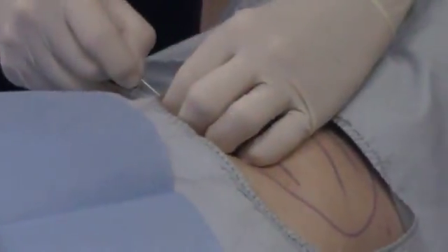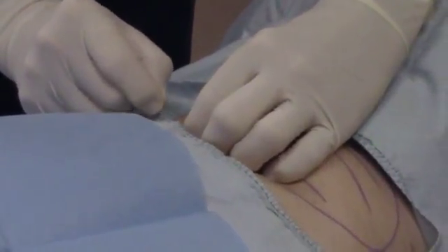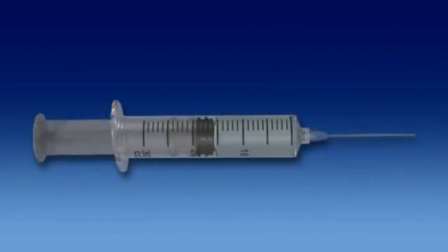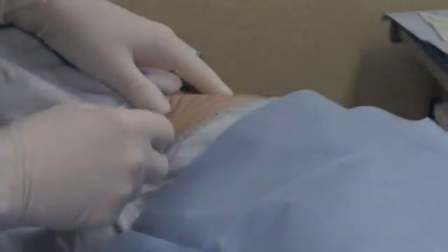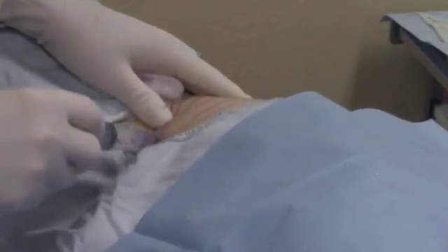Create a puncture hole through the skin only using the 18-gauge needle. This opening provides an access point for the lipoaspiration cannulas. Fill a 20 milliliter syringe with tumescent anesthetic fluid and attach the multiport infiltrator cannula. Insert the cannula through the skin puncture site, entering the subdermal fat layer.